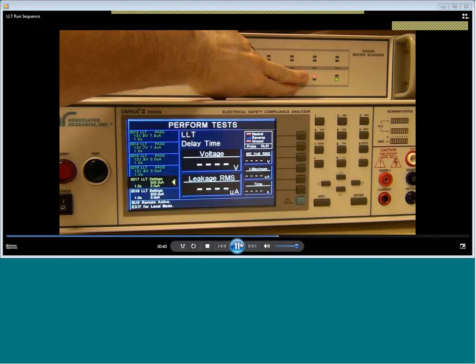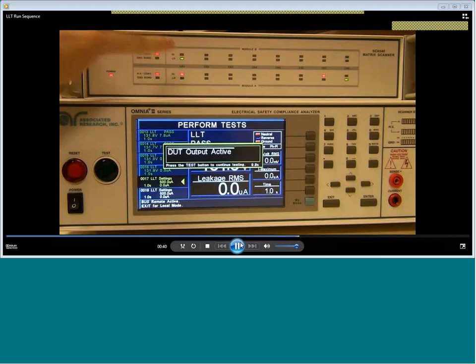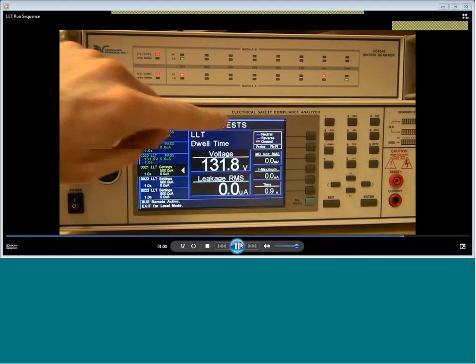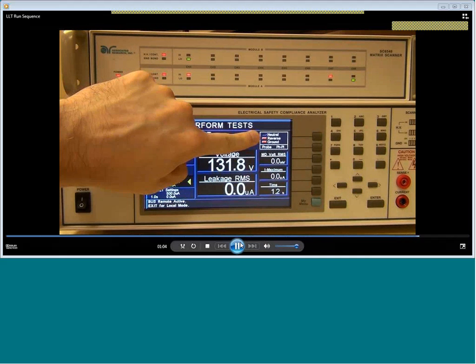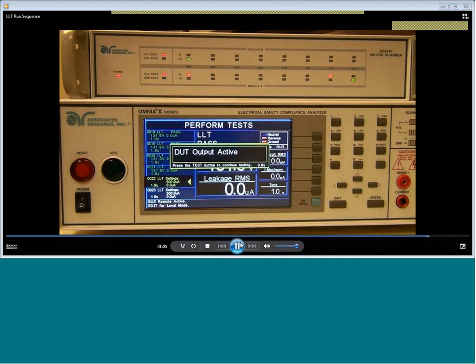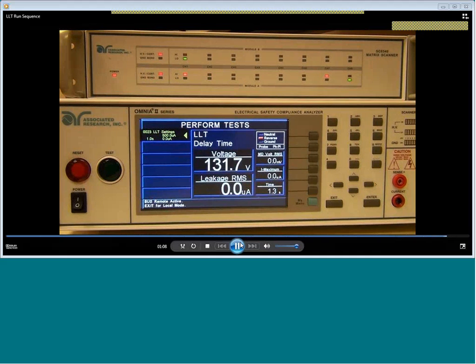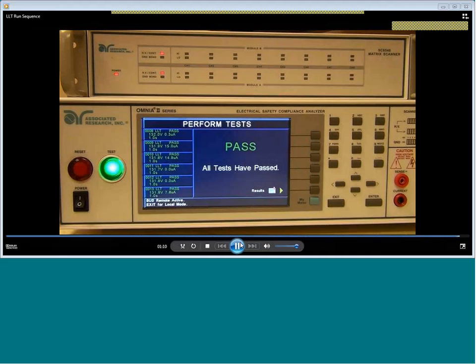So you see I have that patient lead 1 to patient lead 2 with probe high and probe low set, and I'm just multiplexing out these different measurements. Now obviously, I'm not getting a reading here because I'm just running it up an insulation barrier. I don't have voltage applied to these resistors. It's just a simulated setup. I could apply voltage to these resistors to get a value, but I really just wanted to show you how this would be set up. That's the more important point here, is to show you how a test like this would actually run.